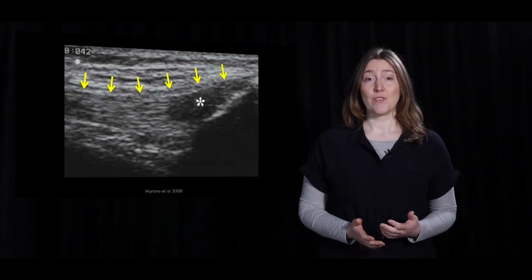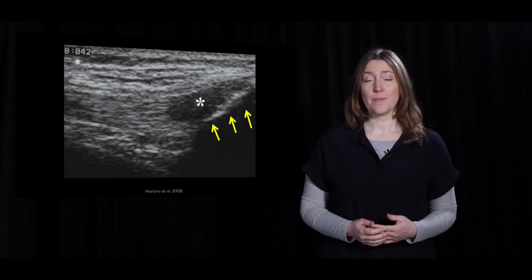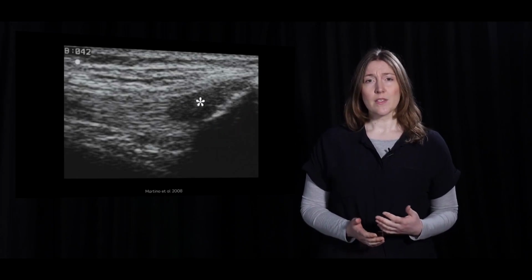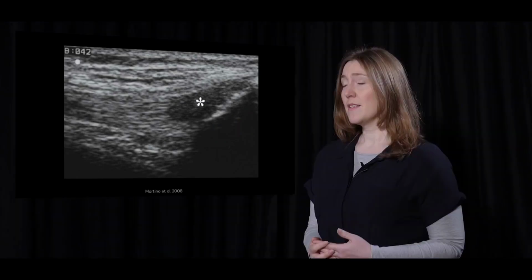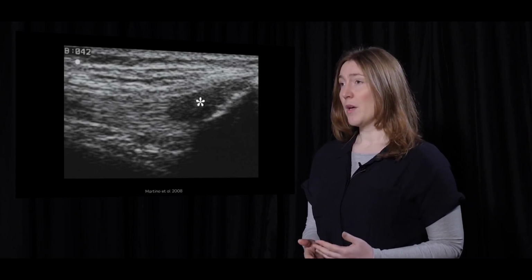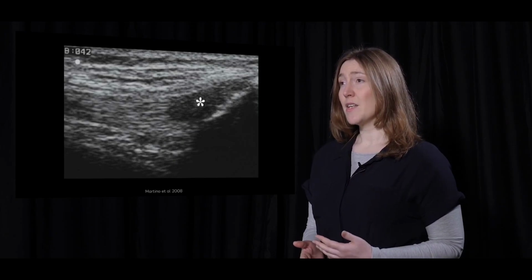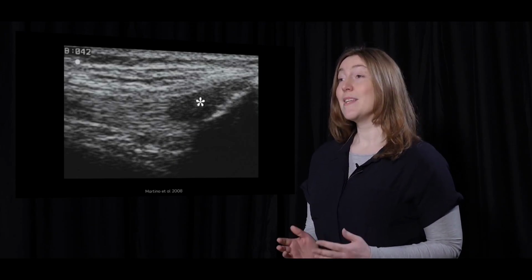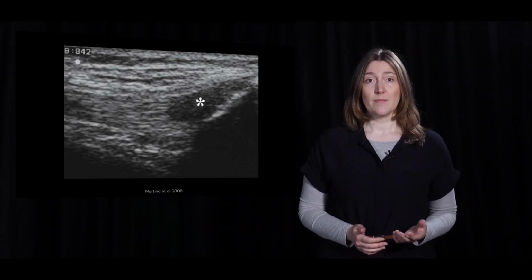Here you can see the quadriceps tendon inserting to the patella bone and retinaculum. Do you see the hypoechoic zone in the quadriceps tendon near its insertion next to the patella? A white asterisk symbol is indicating this hypoechoic zone. Such a dark zone inside a tendon could definitely be pathology, for example, a partial tear, but in this case it's not. It's an example of an artefact.